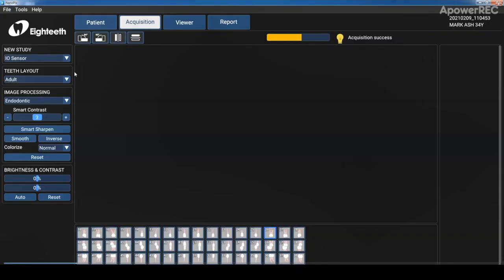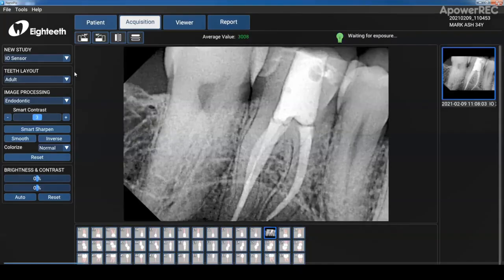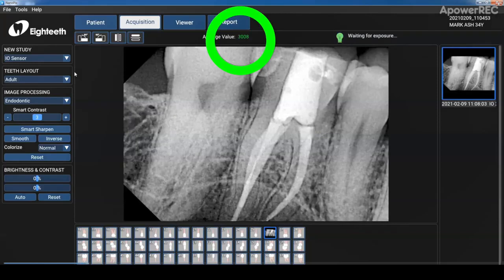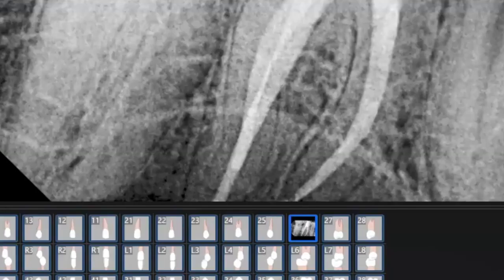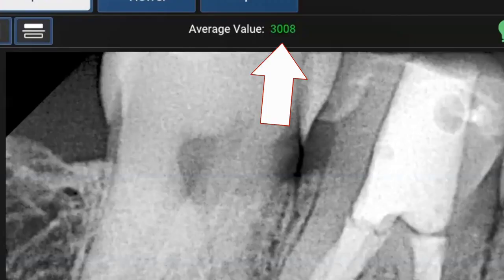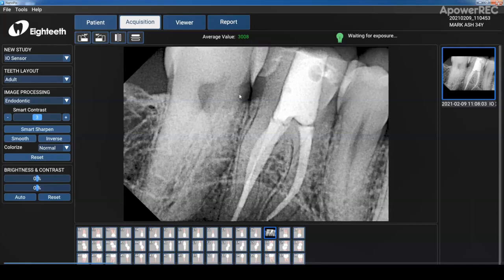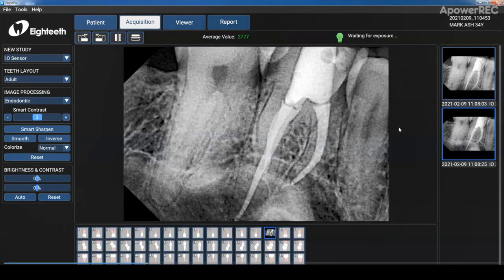The software lets you know if you've under or overexposed the sensor by providing a color code value in the center of the preview screen. And of course I cone cut the palatal root so I had to take another one. And the average value is indicating green so that means that we have the correct setting for the sensor. And all images captured are automatically saved to the database so you don't have to worry about losing an image.